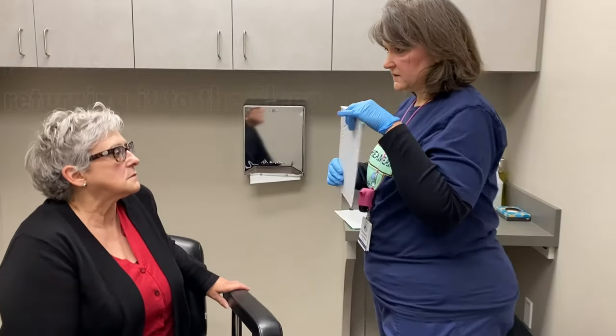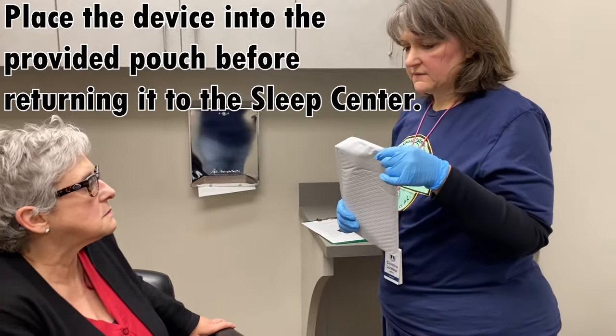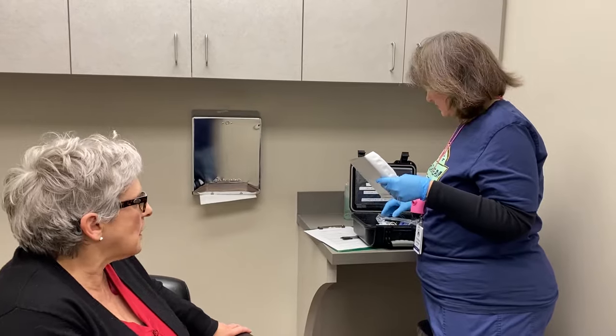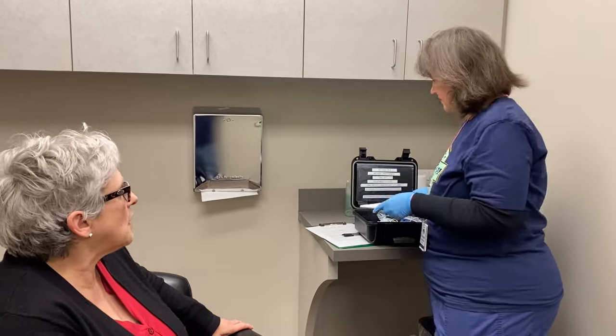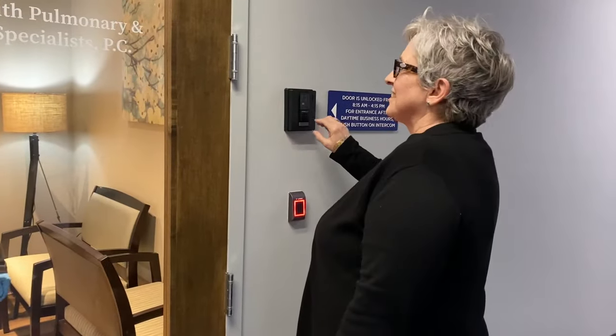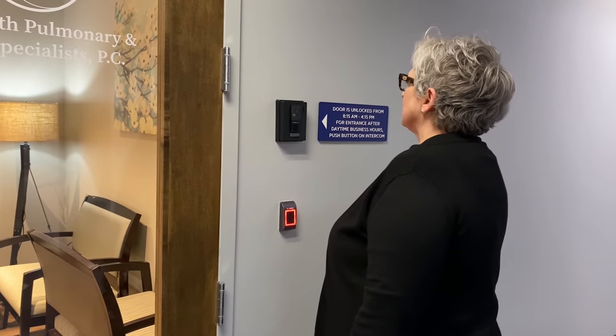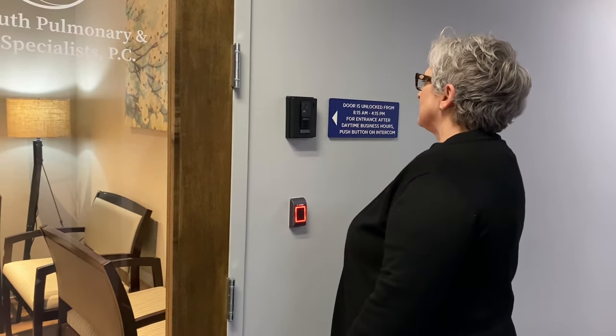In your box there's a little pouch — slide the device into the pouch. You don't have to seal it up, just kind of put it in there to give it extra cushion when you're transporting it. If the door is locked when you come to return the device, just ring the doorbell and the technologist will come to the door right away. Make sure you return the home sleep study device the next day between 6 a.m. and 9 a.m. Failure to do so may result in extra charges.